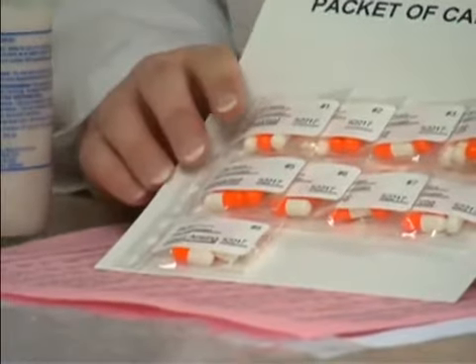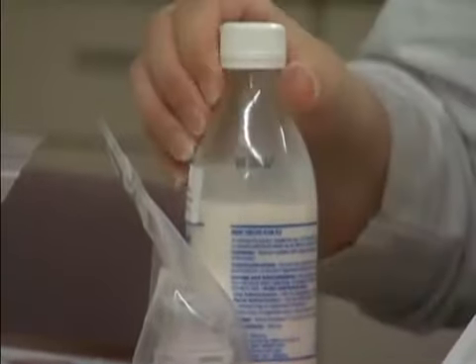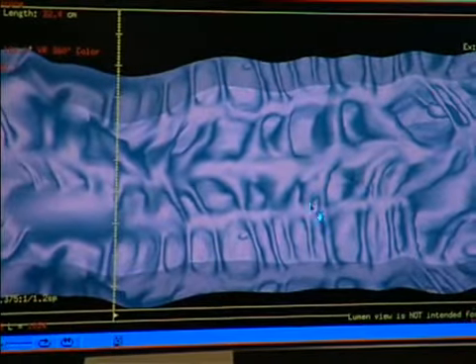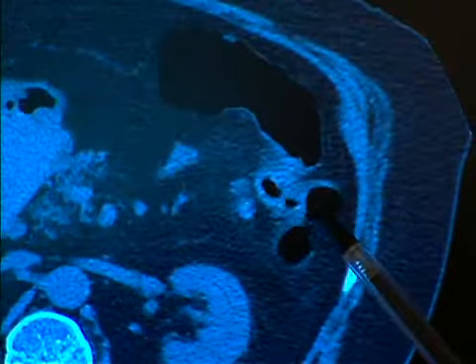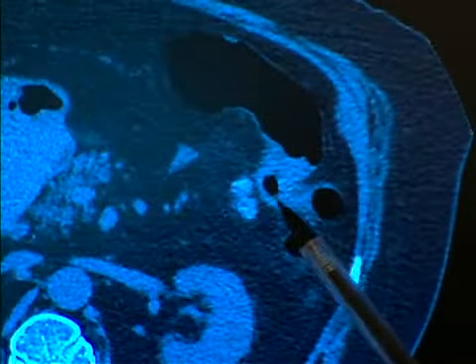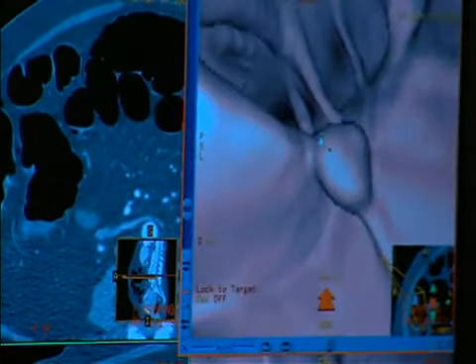But doctors are developing ways which will only require patients to take barium tablets and a small amount of liquid without changing their diet. The technology uses CT scans to create 2- and 3-dimensional maps of the inner surface of the colon and rectum. And there's 2 ways that I look for polyps. One is by using the 2D CT scan to look for narrowing and defects of the colon. I can just correlate that very quickly with the 3D view. That mass is a polyp and possibly a cancer.